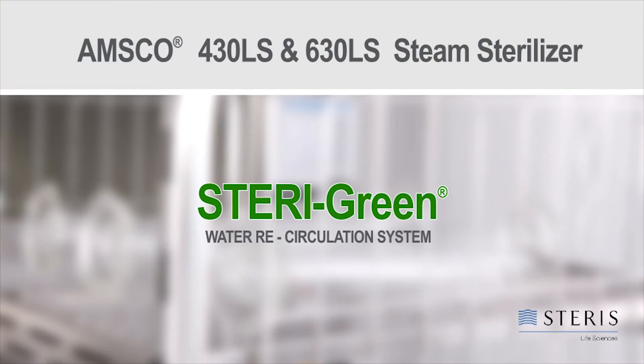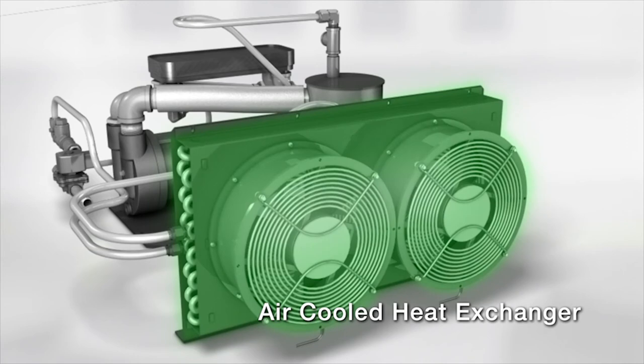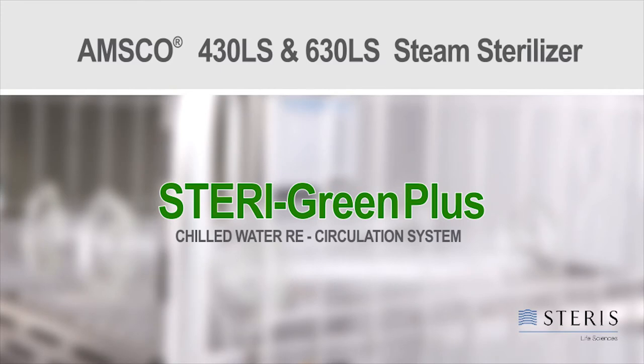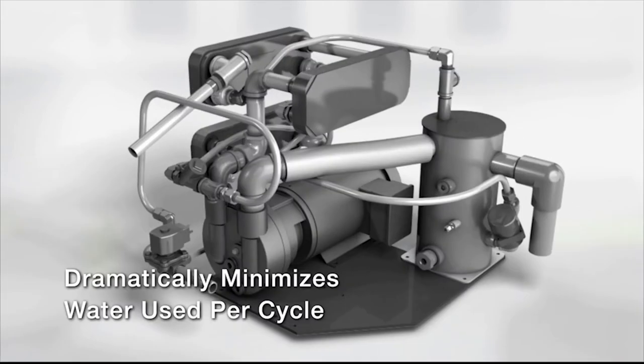The SteriGreen system utilizes a mixing tank and an air-cooled heat exchanger to cool and recycle vacuum pump water and steam effluent, reducing water consumption by up to 55%. For even greater savings when connected to a building chilled water loop, the SteriGreen Plus can reduce water consumption by 99%.